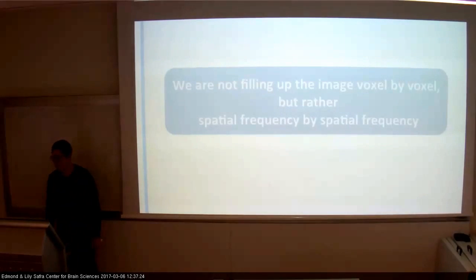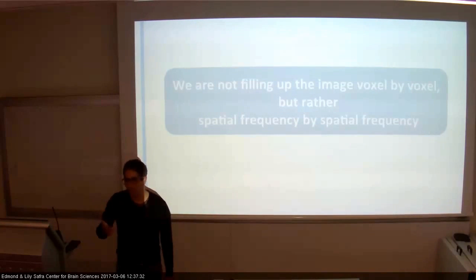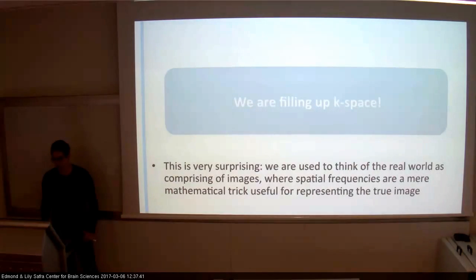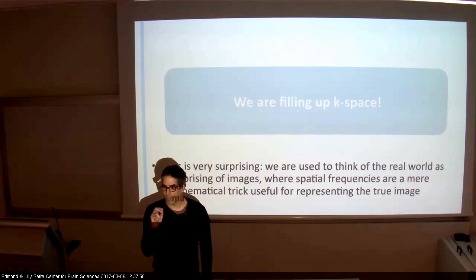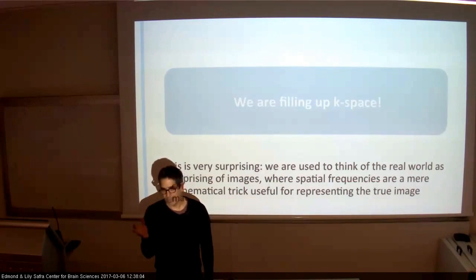Actually, we're not acquiring this signal in time and then doing the inverse Fourier. What we are doing is trying to fill K-space directly, just to say what is the weight that we're having. The intuition for that is always hard. Besides the people actually doing it on a daily basis, most people, even if they understand it, forget it and need to teach themselves again and again. At least that's the case for me. I understand it, and then I forget.